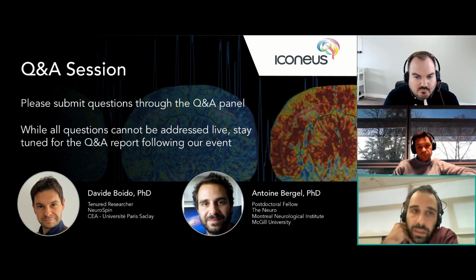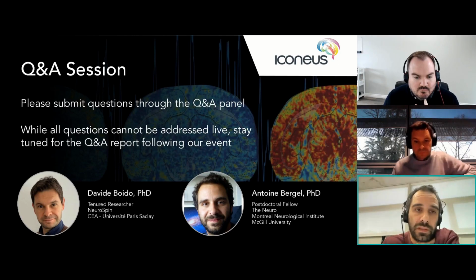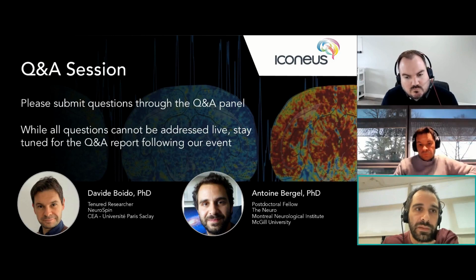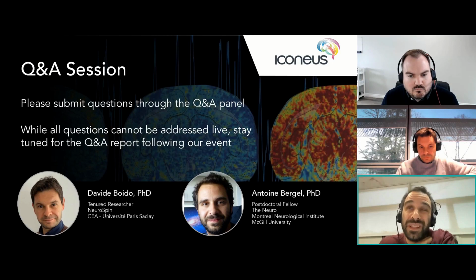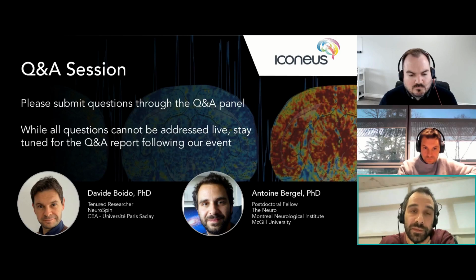And the second thing to keep in mind is that we are mostly using planar waves, right? So with focused waves, you can definitely change the pressure, perhaps even trigger electric activity. Here, I don't think that occurs. And when the animal is not grounded, you actually see the ultrasonic bursts. So if things are done properly, I would not worry too much about the two interfering.